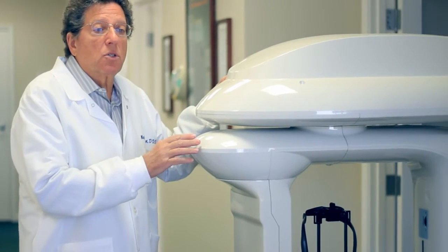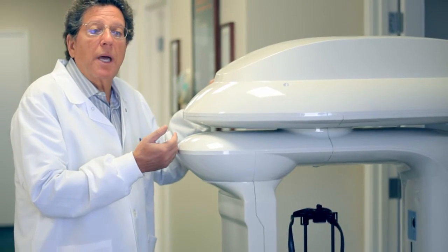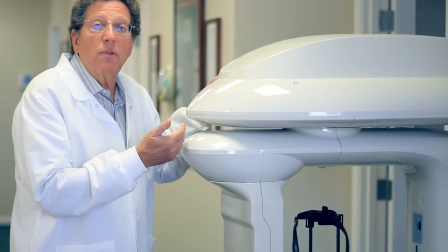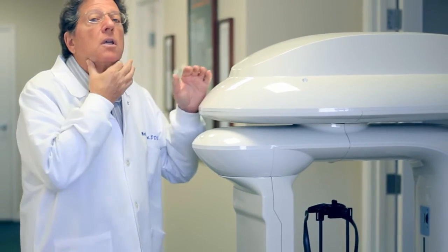It takes pictures also of all your airways. So it's also good to help diagnose people that have sleep issues, whether it's apnea, snoring, or whatever the condition is. It shows us the size of your airways in the nasal complex and your pharynx.